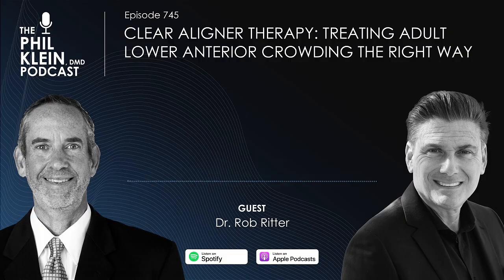Yeah. What a great adjunct now. And those functional appliances, what is the typical time period that a patient has to wear those? And I know it's case by case, but typically, generally speaking, what are we looking at? Oh, they're anywhere from at least 6 months up to a year and a half. At that point in time, they're ready to have those veneers placed. Well, it depends if it can be fixed with a functional appliance. Sometimes it cannot. Sometimes a functional appliance serves as the starting point. They still need to go through orthodontics.